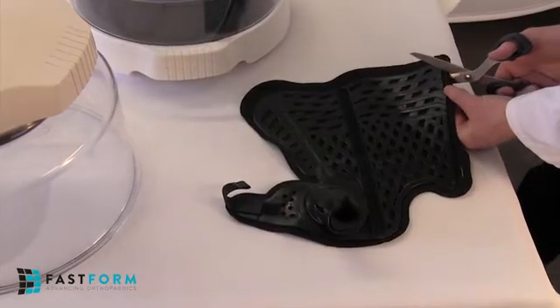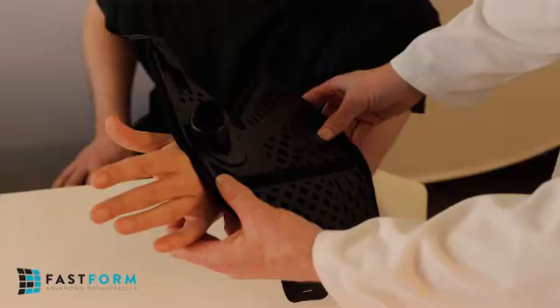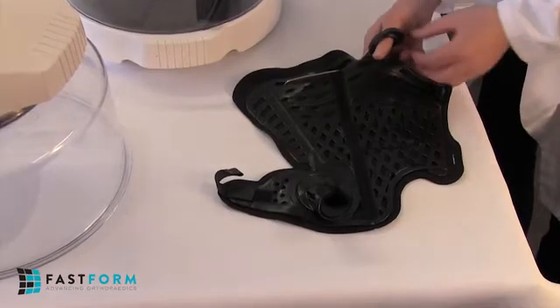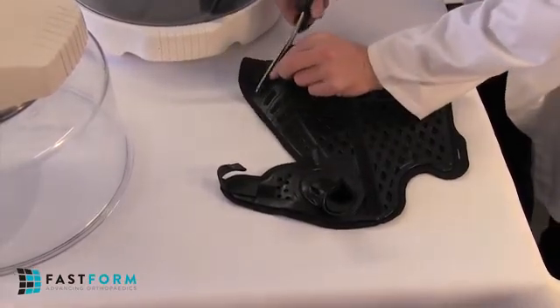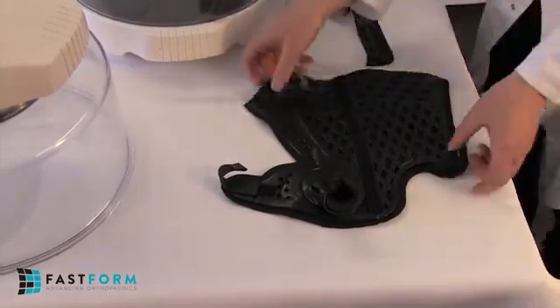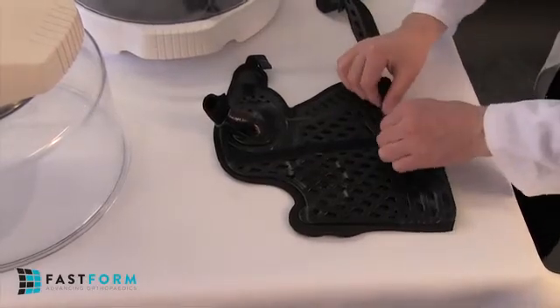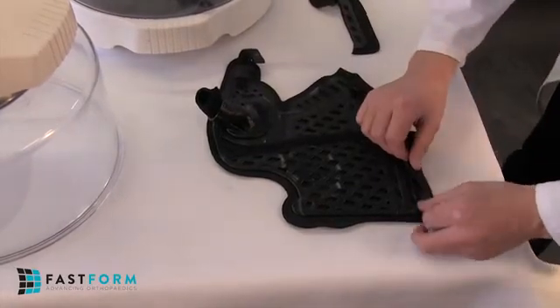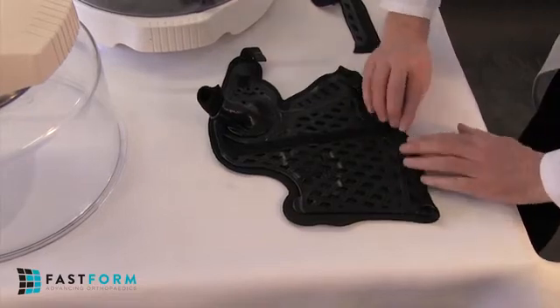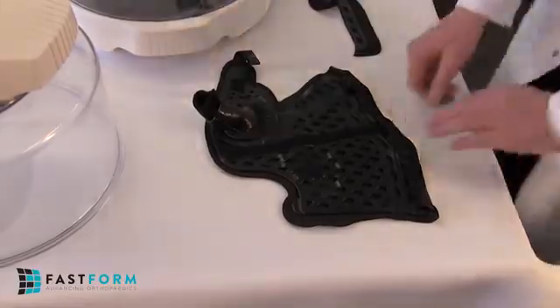If the thumb spica requires shortening, it is easily customizable thanks to the built-in trim levels and fold lines. When the appropriate fold line has been selected, always leave one trim level more to allow for the final length required. Then, simply cut along the chosen trim line and fold and stack onto the next level. When shortening the thumb spica by only one trim level, simply fold and stack the first level distally onto the next level. In either case, after folding, compress the two levels together and smooth out to create a comfortable padded cuff. This feature prevents irritation, which frequently occurs using traditional casting materials.